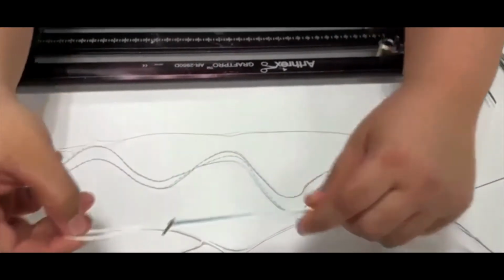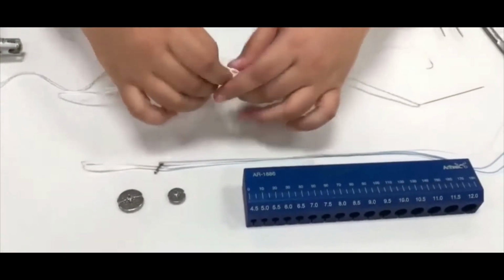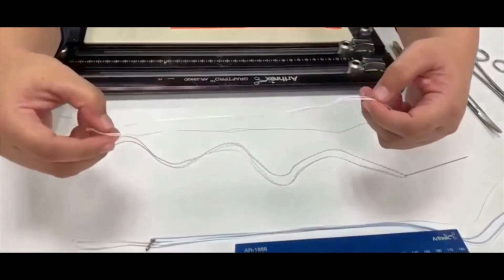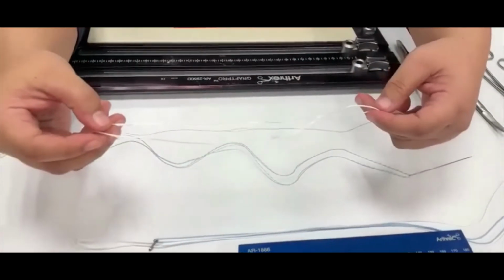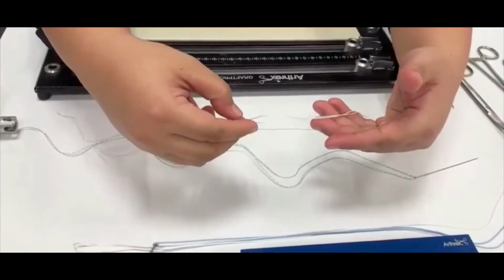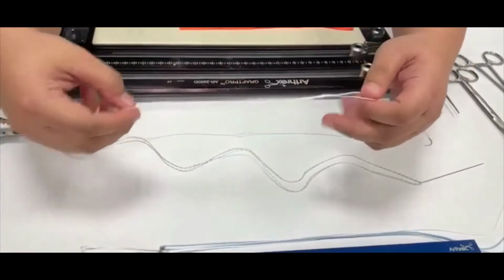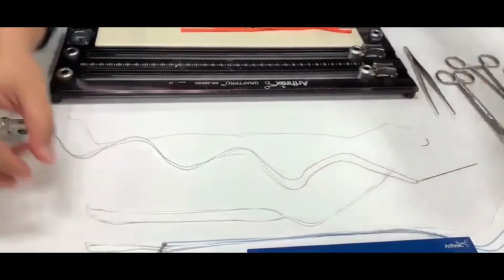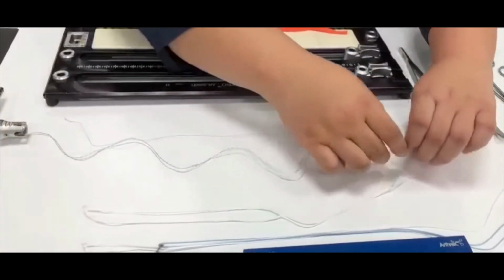Okay, next is an ABS TightRope, which is the adjustable button system. It also comes with a white suture tail to shorten, and this TightRope can elongate and shorten also. Okay, we also need a number 2 FiberLoop.